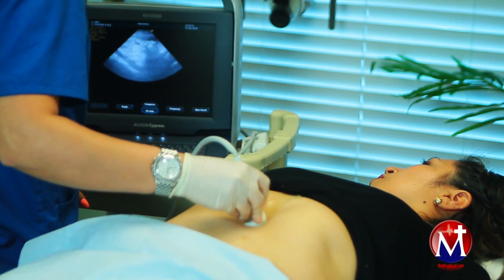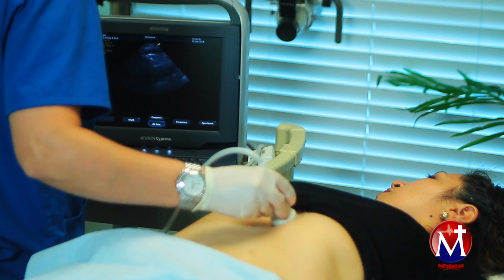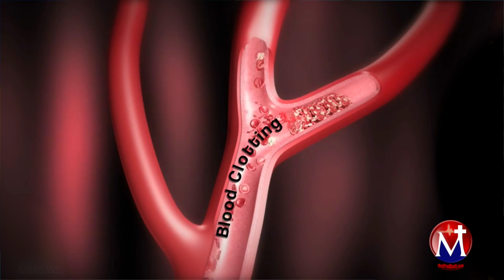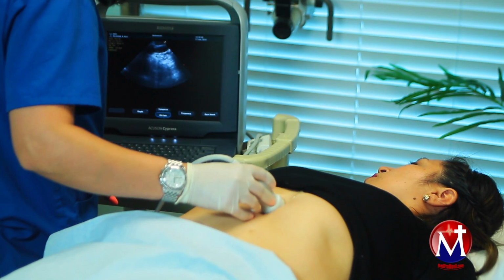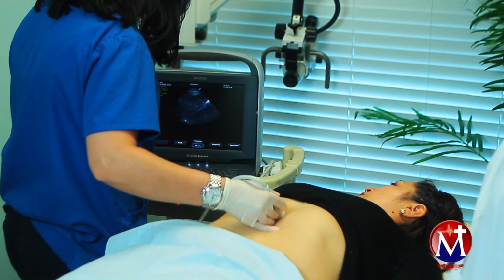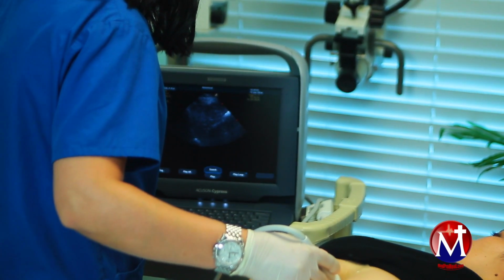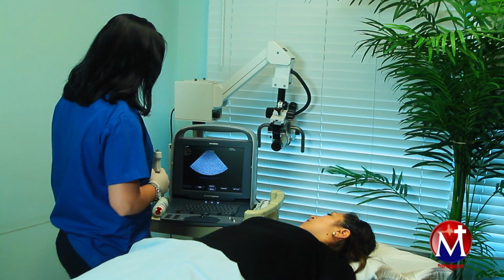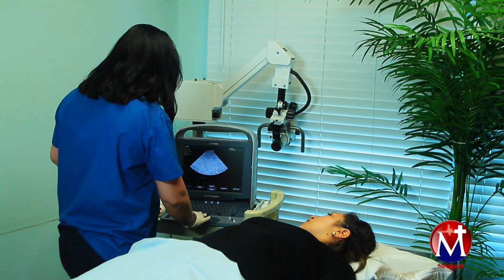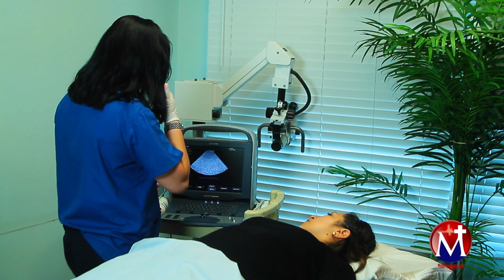Ultrasound can also be very useful in detecting cysts, abscesses, obstructions, fluid collections, clots, and even infections in the abdomen. In a recent study, the general practitioner's anticipated patient management strategy was changed for 64% of patients following upper abdominal ultrasound. Negative findings are very important for the exclusion of diseases and therefore for reassurance of the patient.